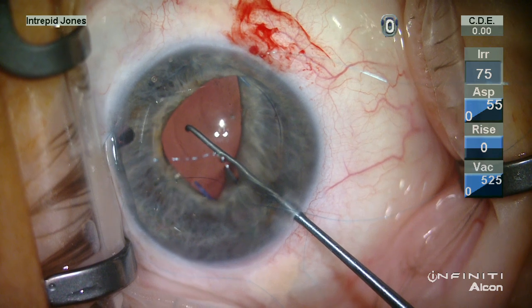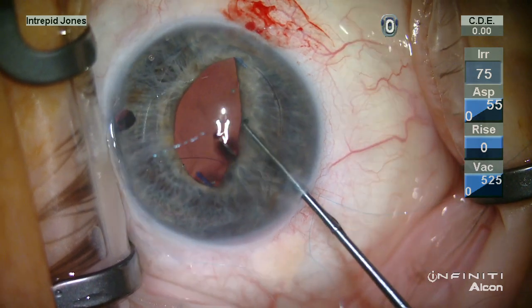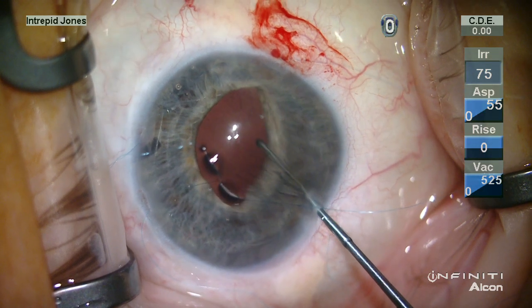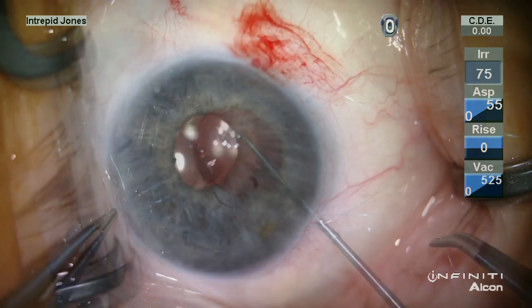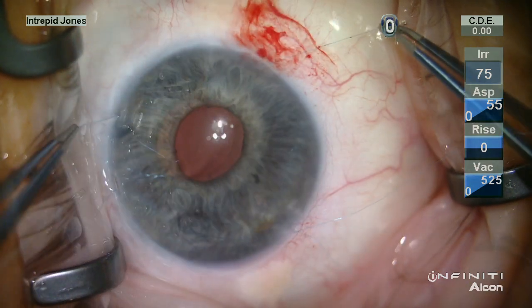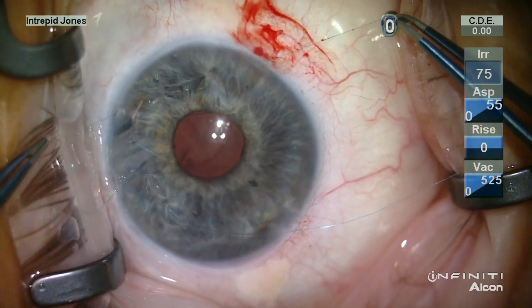The optic is then prolapsed posterior to the plane of the iris, and this allows the iris and suture complex to slide along the haptic and thus round out the pupil.